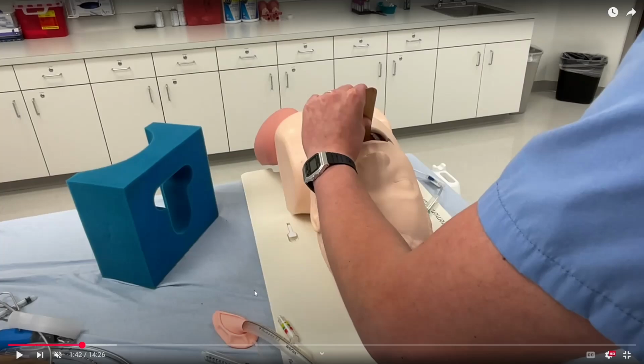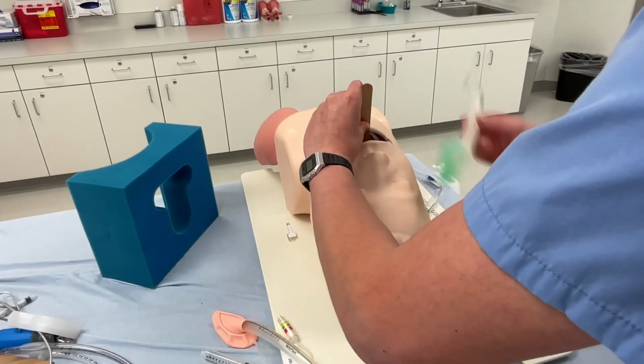You'll notice it's nearly identical. One of the main differences, though, is the technique with the traditional LMA involves tracing it with the index finger all the way down, while with an I-gel, it's much more rudimentary, and I've seen practitioners who just effectively push it in there in one fluid motion without tracing at all.